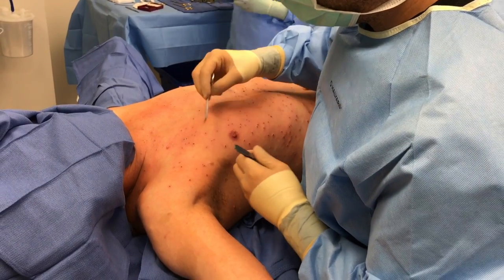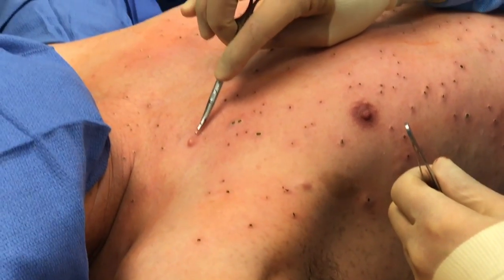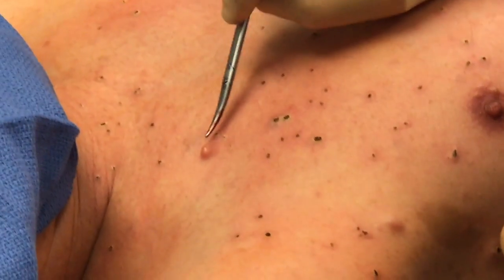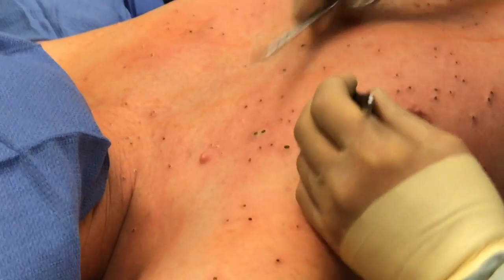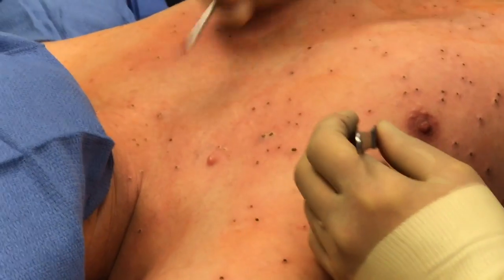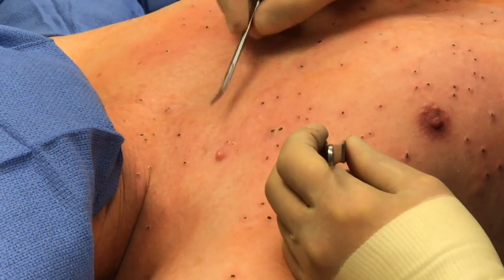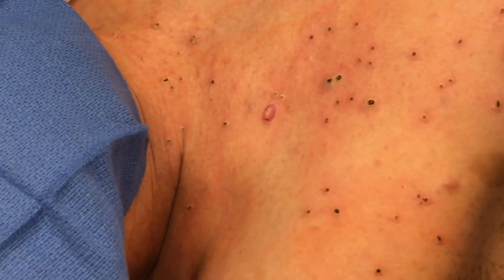We have a different type of nodular cutaneous or raised tumor of the skin here. Now this is a little bit too large for electro-desiccation, so I'm going to go ahead and excise that out. There are different ways to excise it — in an elliptical fashion as shown previously, or picking it up and essentially cutting the base of it off until we get a flush surface.